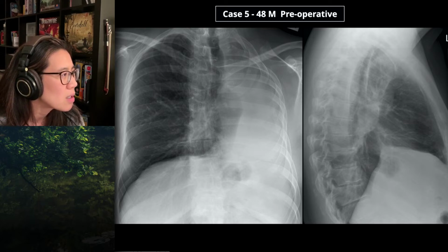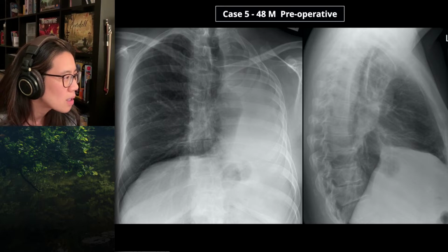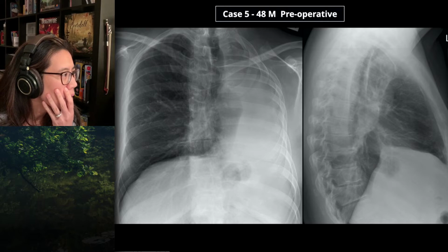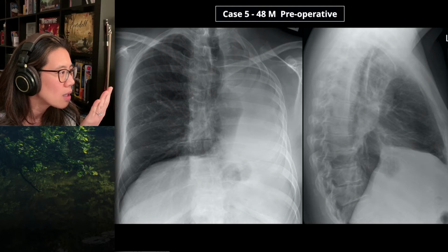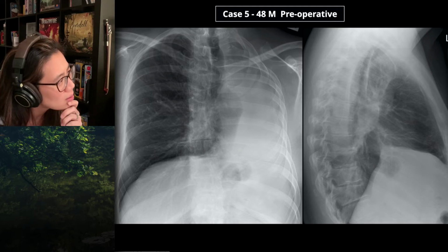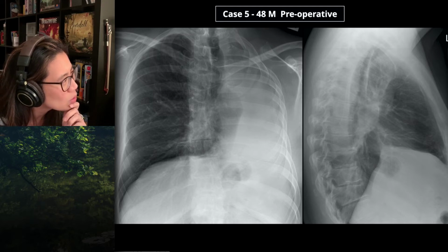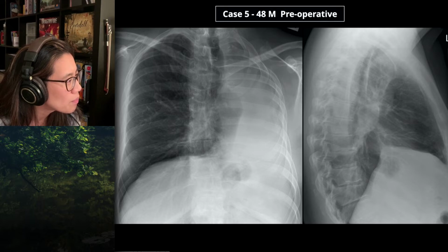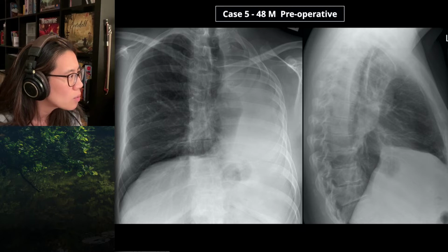Now, where would you add as a review area for a person who's only got one lung? For a person who's only got one lung, the review area would be the area which is obscured by density because you no longer have a lung there. So is that where you're getting at? I'm not sure. No. Not worried about the left side. I'm worried, he's only got one lung. It's the right one. Yep. Your review areas are the apices, behind the heart, under the diaphragm, where you've got overlying structures. Yep. So over the spine would be right.